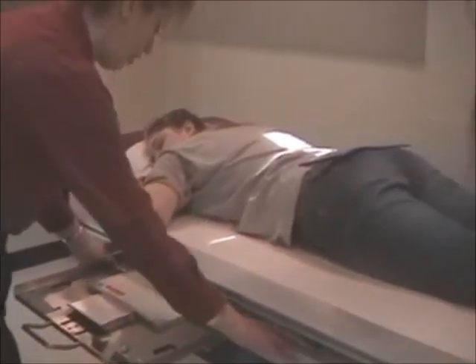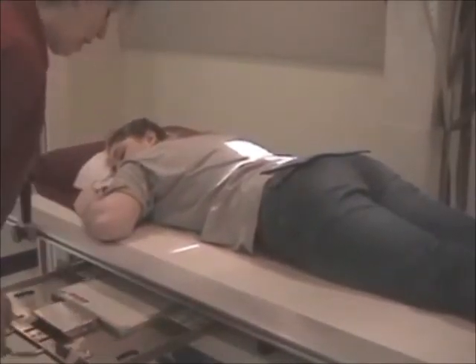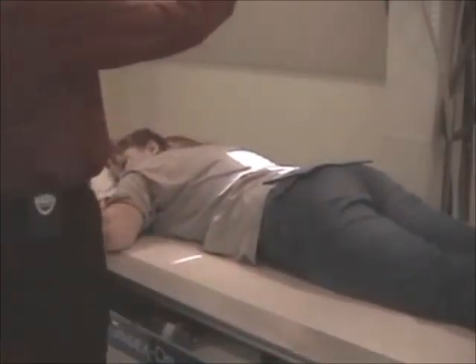You've got to change the direction of your collimated field. We do not have automatic collimation here, so now I have to make sure I go 10 by 12 crosswise. Tube and the film are lined up, so now all I have to do is focus on the patient. We know the stomach is on the left side, slightly off of midline, so I just moved the patient to that area. Now I'm going to use my reference marks again.